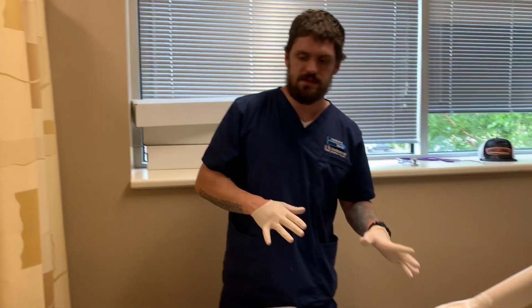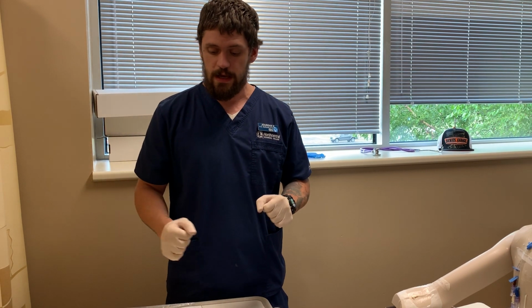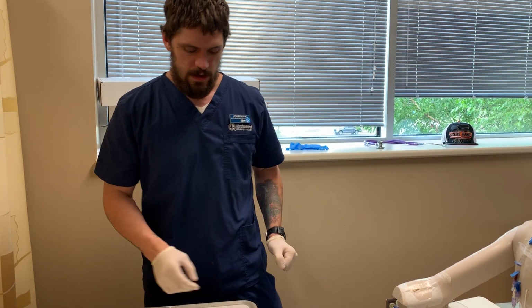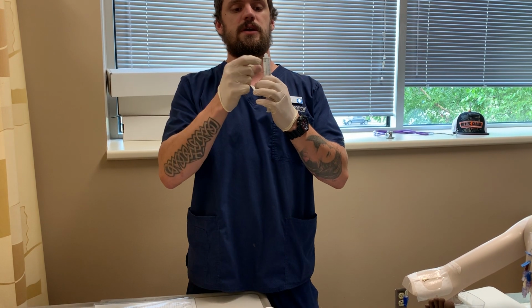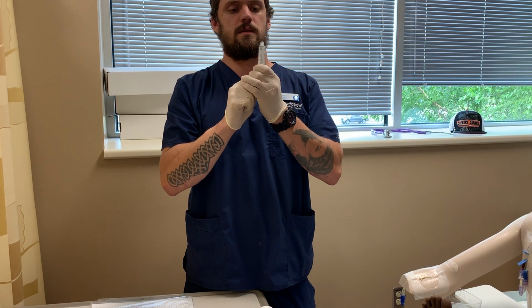And if this were perhaps a small child, we would do our math a little bit differently. We would include weight into our equation, as well as probably we would administer this drug over a longer period of time. So, okay. I am going to first do a saline flush. And I'm going to get the air out here.